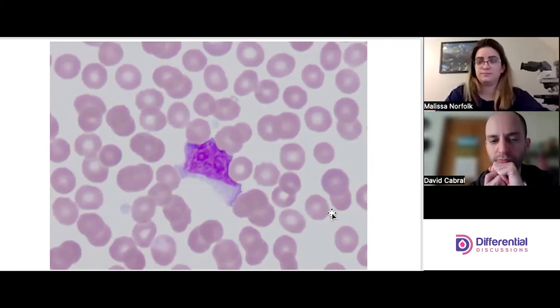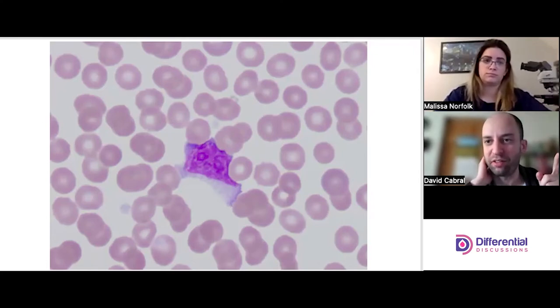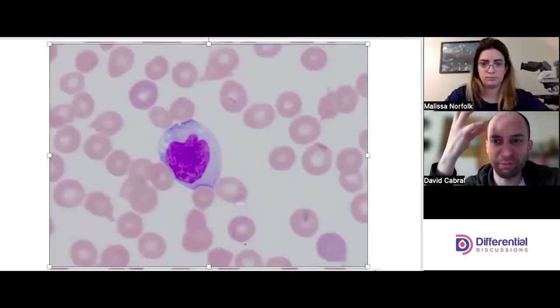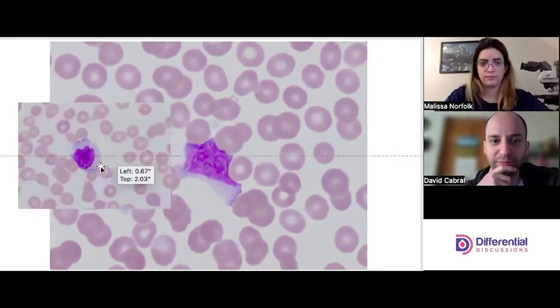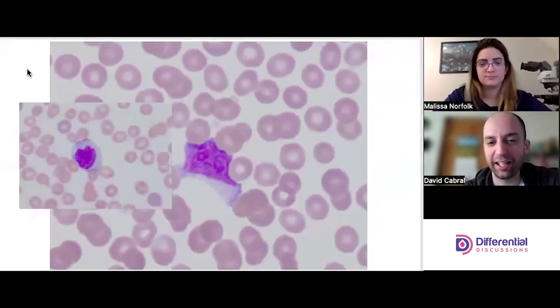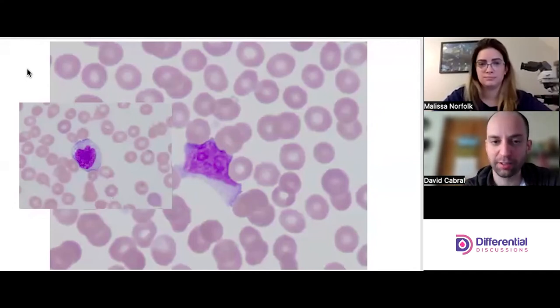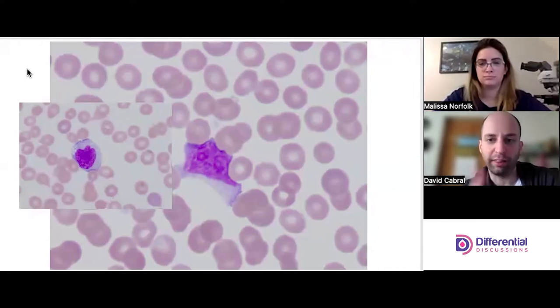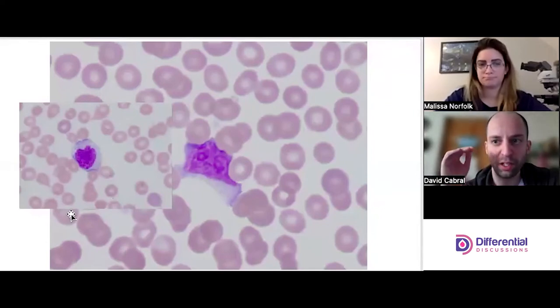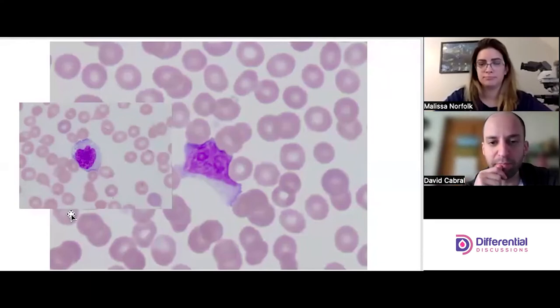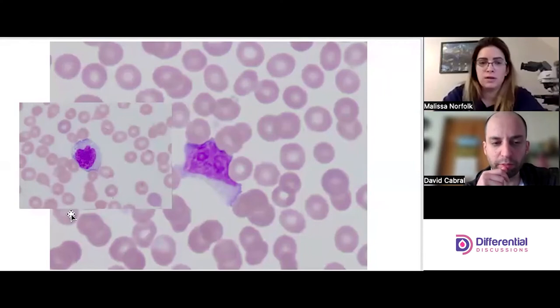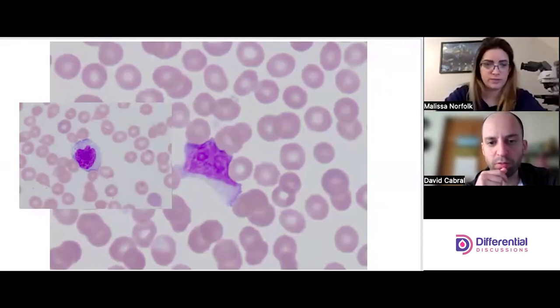That deep dark blue combined with the white striations makes this cell look really angry. Looking back at the tricky mono from before — you can see that it has that dark blue but it just isn't bleeding inward; it's not as rich. The reactive lymph's cytoplasmic projections are actively stretching to grab the red cells around it, whereas the mono doesn't move much from the edge of the cytoplasm.